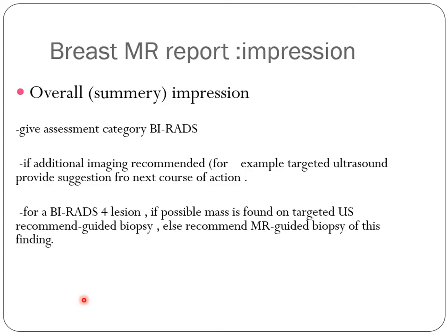Breast MRI reporting impression is very important. It is the overall summary impression to give to the physician. Give the assessment category, BI-RADS, just like other modalities.